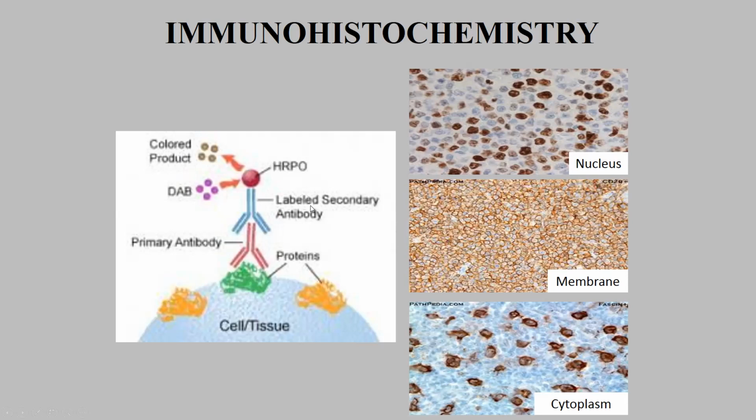After reaction and fixation of this antibody, we wash the tissue, washing this sample.